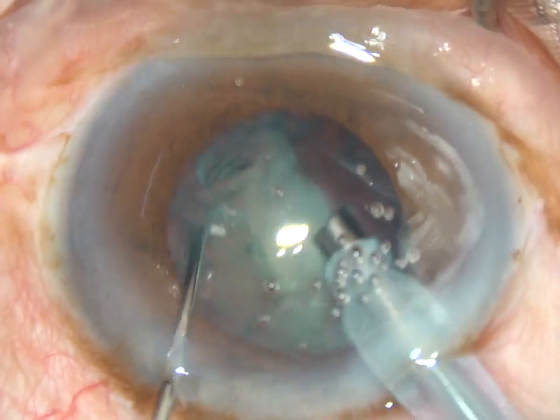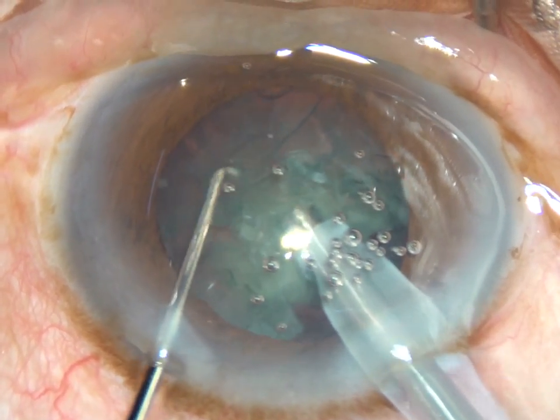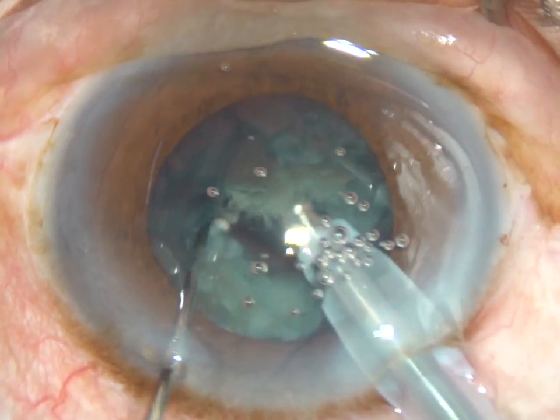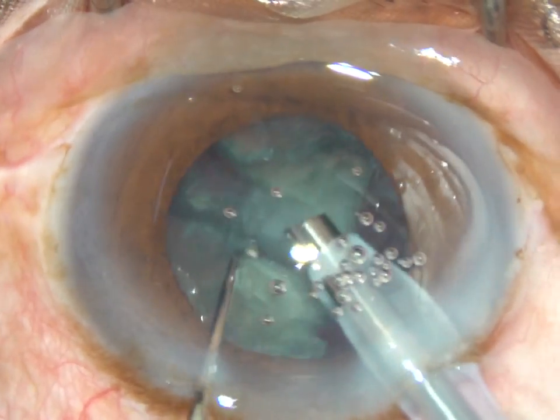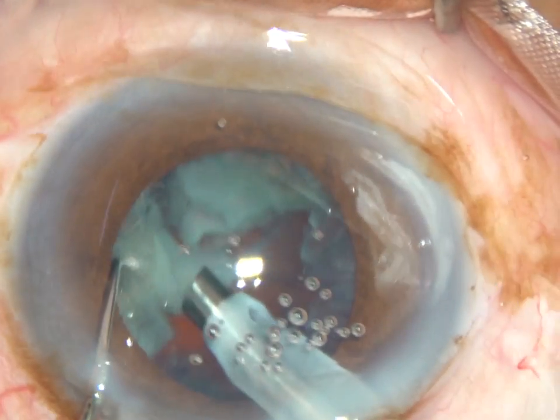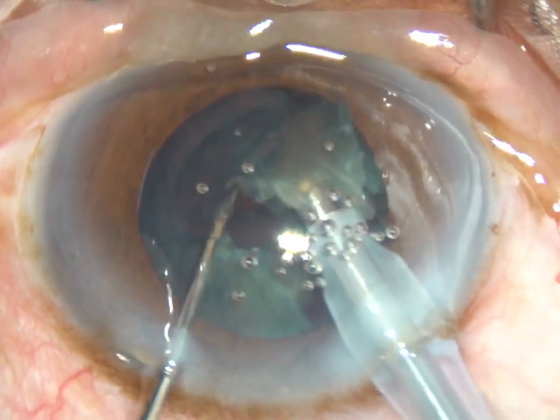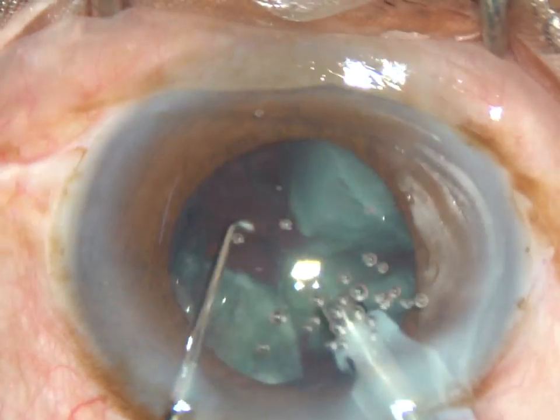It is emulsified and removed. And this is the other hemi nucleus. It is chopped into two pieces. And now each nuclear fragment is emulsified with ultrasonic energy.